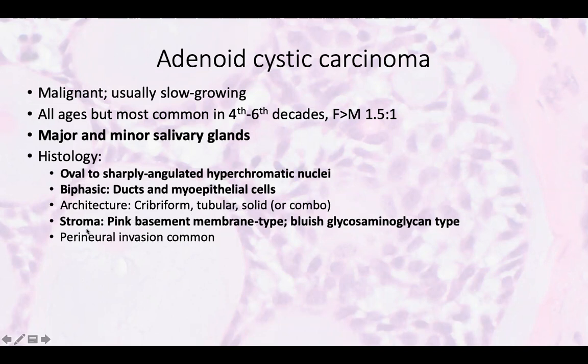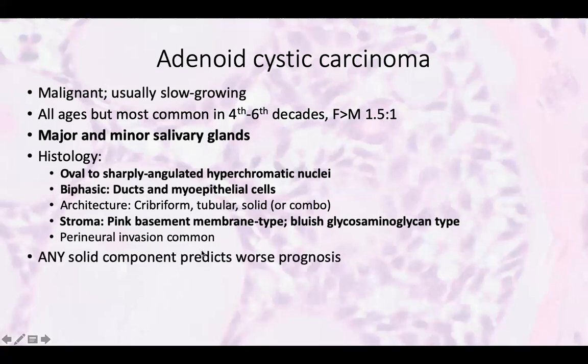And then perineural invasion is super common. Like if you don't see perineural invasion, you got to wonder if you're even dealing with the right tumor. And in fact, these often show intraneural invasion, which I'll show you as well.